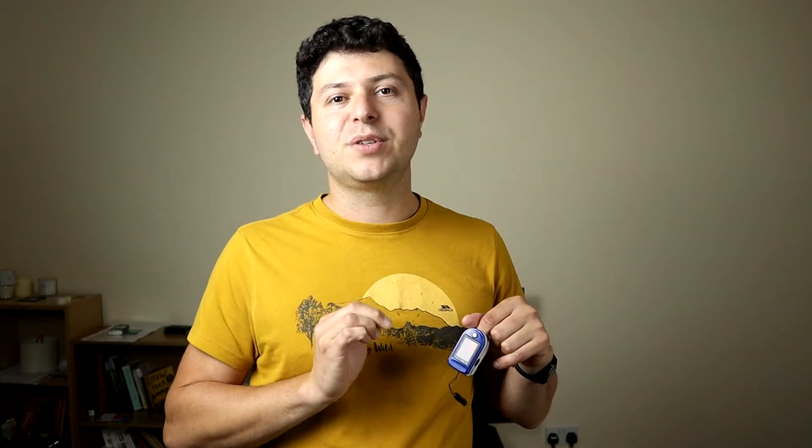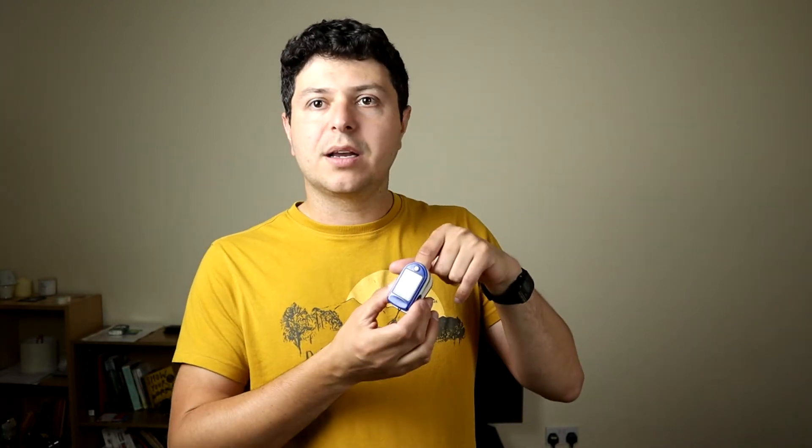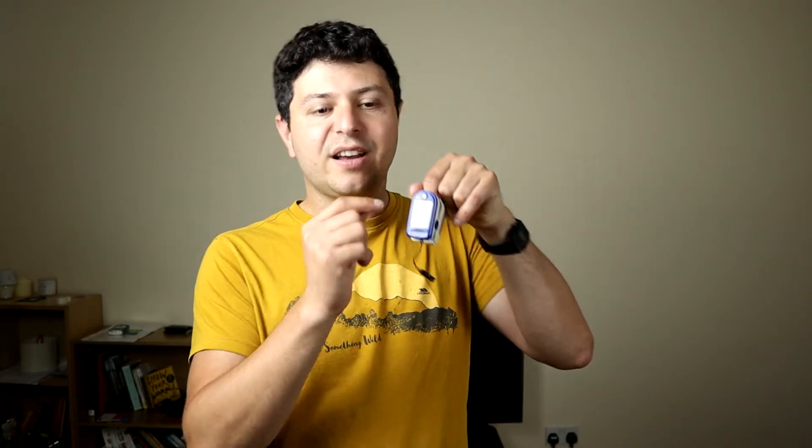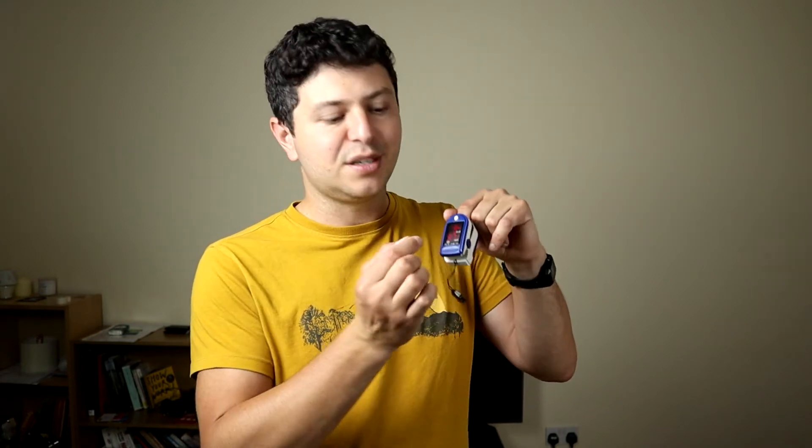When it comes to oxygen saturation, this is a little tricky. Oxygen saturation is rarely 100% or 99% — a normal oxygen saturation is generally anything above 94. It will usually be around 96 to 97, which is absolutely normal. It can be higher if you're on supplemental oxygen, but for example this basic device I have doesn't even display 100 — it can show 99 as the highest because it only has two digits. So generally 94 to 99 is the range of normal oxygen saturation.